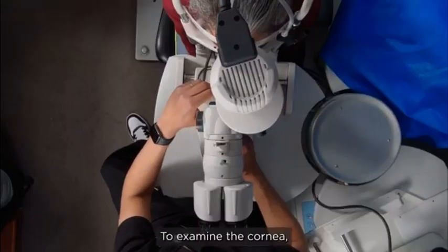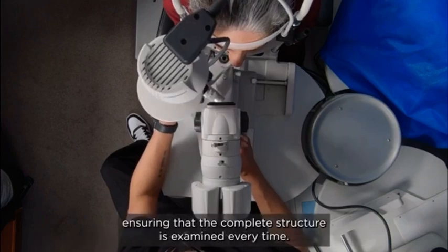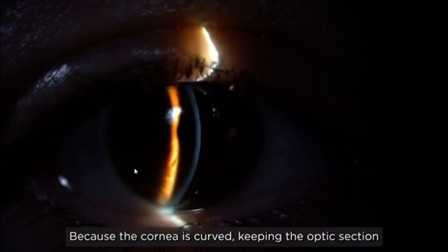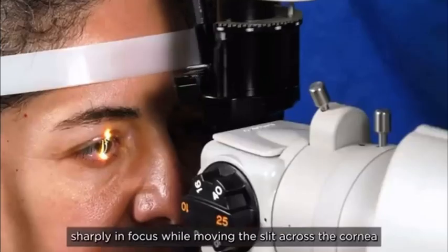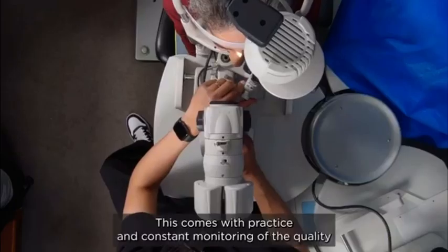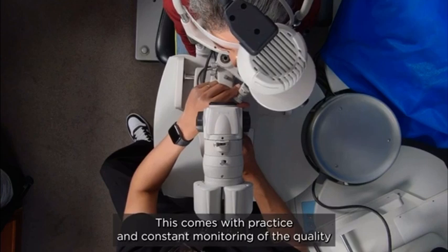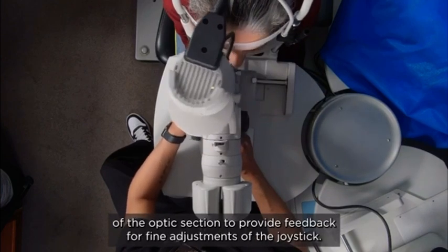To examine the cornea, it's useful to develop a standardized scan pattern, ensuring that the complete structure is examined every time. Because the cornea is curved, keeping the optic section sharply in focus while moving the slit across the cornea requires the joystick to be moved in a slight arc. This comes with practice and constant monitoring of the quality of the optic section to provide feedback for fine adjustments of the joystick.